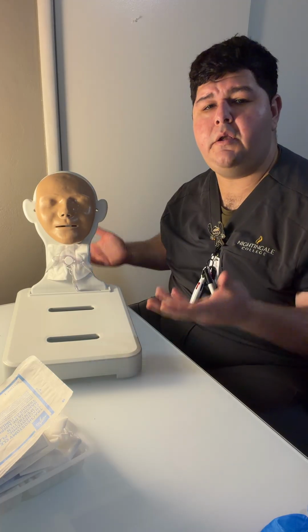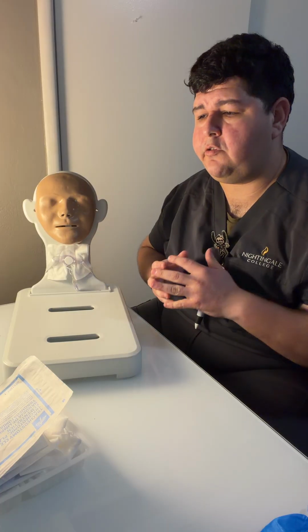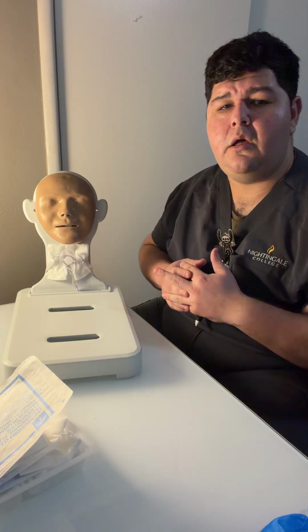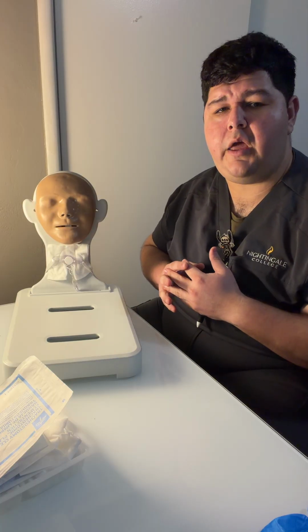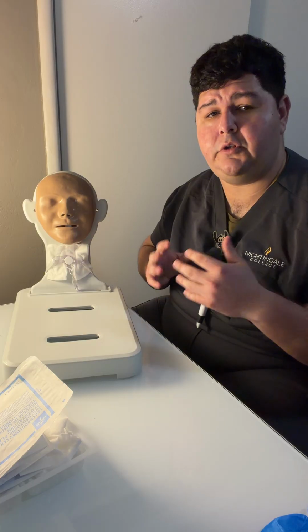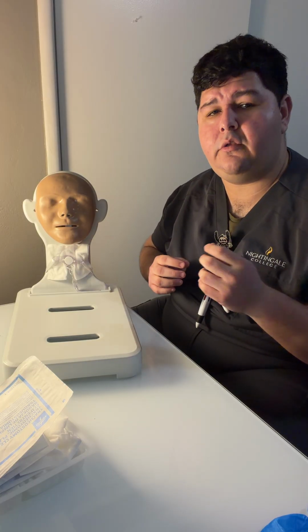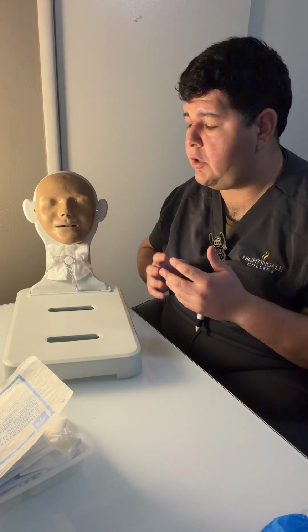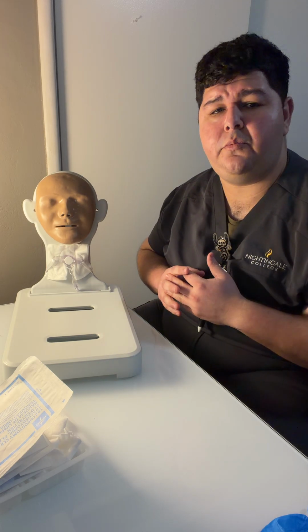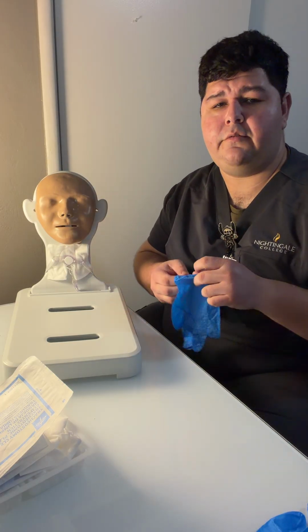We're going to raise the bed to a good working height. Then we're going to place the patient into a Fowler's or semi-Fowler's position unless contraindicated. At this point, we would assess vitals and then place a pulse oximeter on the patient's finger, which should remain during the duration of the procedure. Before we get started, I want to pre-oxygenate our patient for at least 30 seconds. And then at this point, I would suction the trach tube if it is necessary. I would then apply clean gloves.